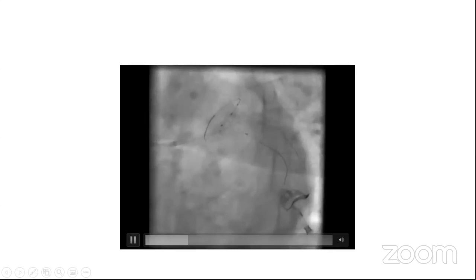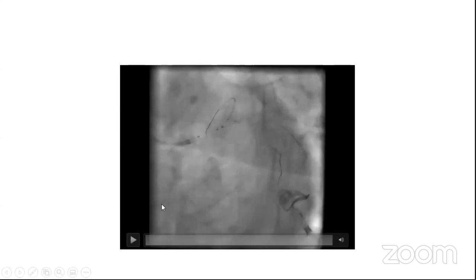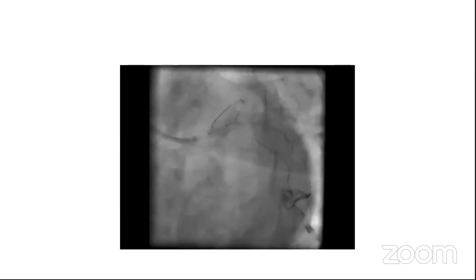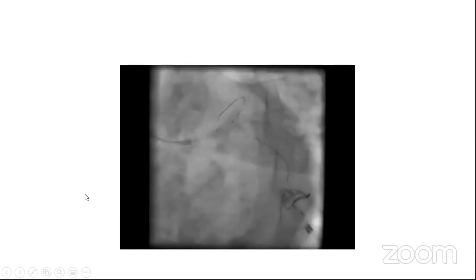First of all, I will inflate the ostium of the circumflex, as you can see here, to readjust and reposition the carina, just as Dr. Karim said, because we appreciate that the atherosclerosis burden from the start is not very big here. Then I take out this balloon, and then I do a re-POT again to the left main, and then I'm going to see how everything looks. So this is the left main. The TIMI flow is much better. The ostium looks much better, and then we will make the inflation for the POT in the left main now.